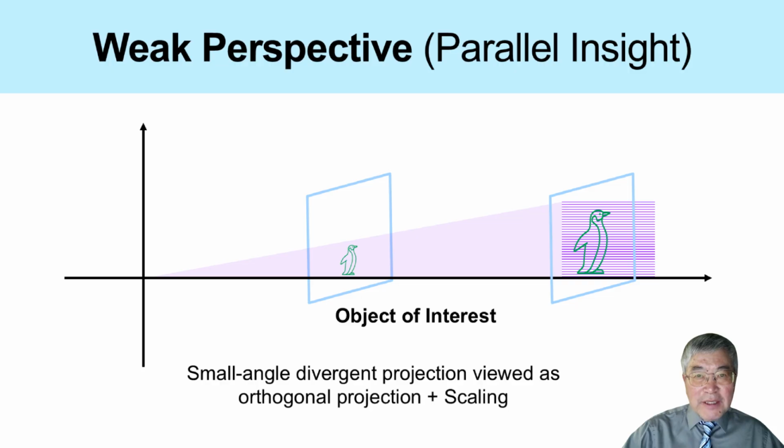So instead of treating the local fan beam projection as a completely different geometry, we say first imagine an orthogonal or parallel projection of the small object. Then scale it up according to the magnification factor. This is a very useful insight. Local fan beam projection can be understood using parallel beam intuition plus a scaling correction. That is why parallel beam reconstruction remains so important. It gives us the foundation, and then fan beam reconstruction adds geometric correction factors.